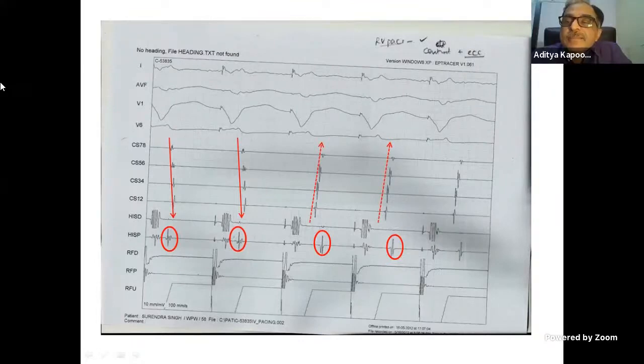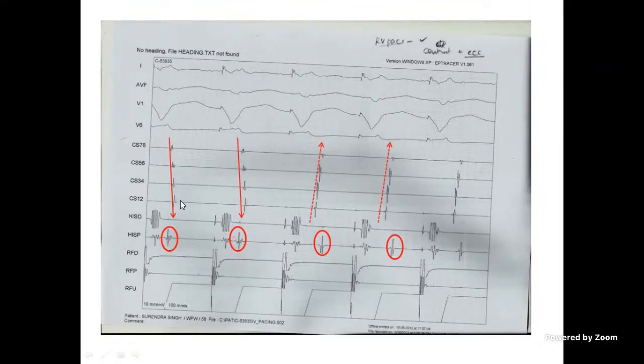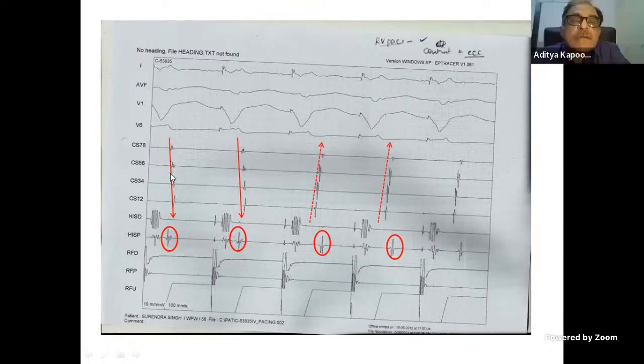Umesh, Sriram? Yes, sir. So what has happened? The conduction has changed from something to something, no? Sir, the proximal portion has now become refractory. So what was this conduction? Sir, it has become from concentric to eccentric.